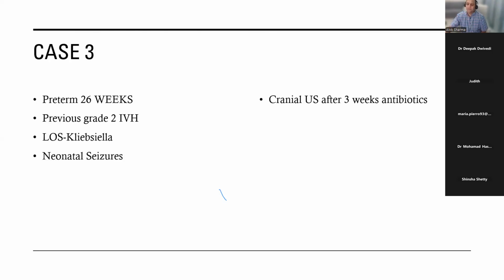Doctor, can it also be HIE? Clinical correlation. So clinical correlation, you're right, says that technically from our perspective, this baby could have HIE. He needed resuscitation. His cord gases were normal. My only question about HIE is, would you see necrotic lesions right at the start with HIE? No, but the cerebral edema, that, again, could be. It may be a mix of both because he needed resuscitation.